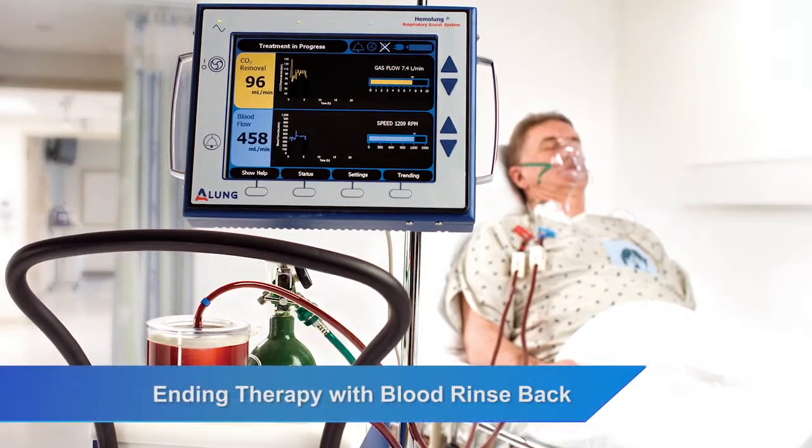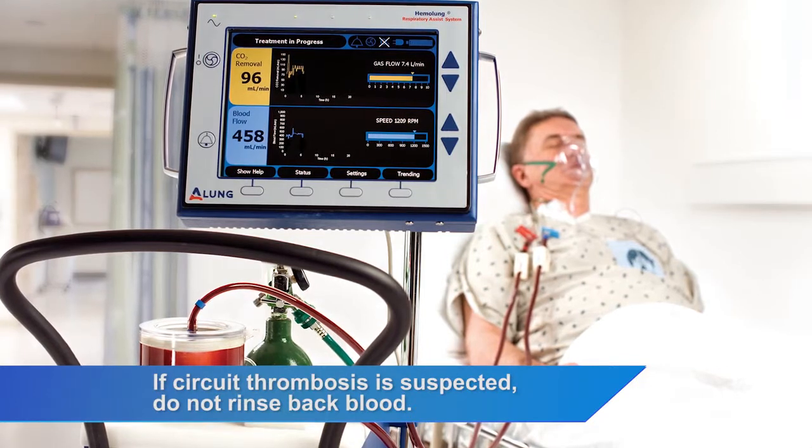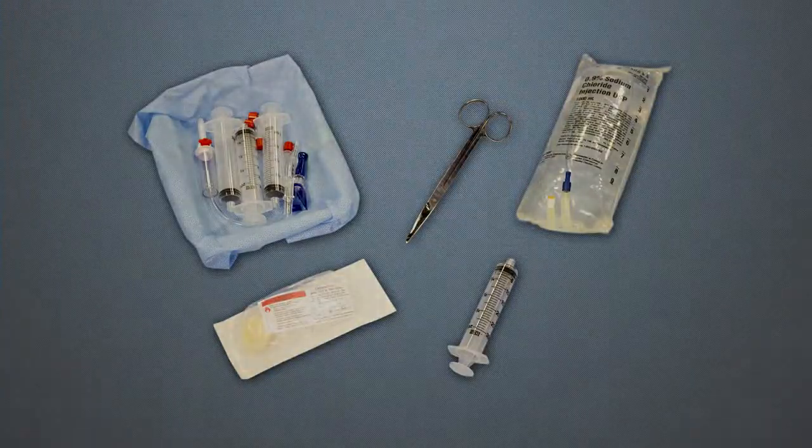Ending therapy with blood rinse back. Following therapy, the physician may decide to return blood from the circuit to the patient. Prior to rinse back, collect the following supplies.